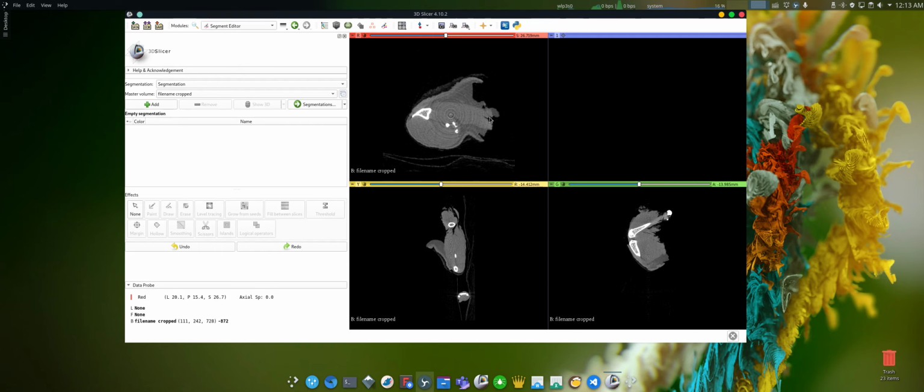If the images were acquired and converted by the imaging scanner to express the pixel value in Hounsfield units, the bones will be around 1,000 Hounsfield units, over 1,000 Hounsfield units. The tissue will be within about 50 to 100 or 200 Hounsfield units, and the air, which doesn't attenuate the X-rays, will be within the range of 0 or negative values.